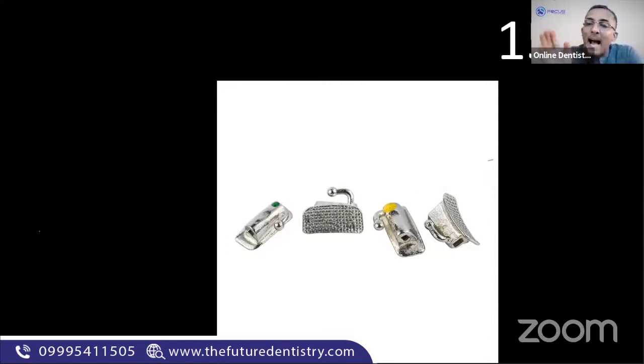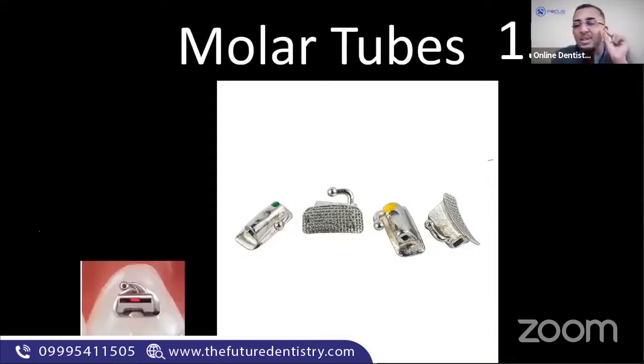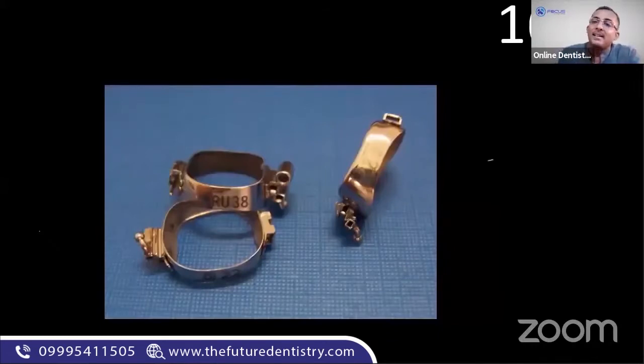Bondable molar tube has this mesh, so that you can bond onto the teeth. Weldable molar tubes are welded onto the molar band, which can be the next question. What is the answer? Identify this can be the next question. Anybody wants to give a try on what is this next question? Identify this. Molar band, it is a molar band, but the choices can be very confusing.